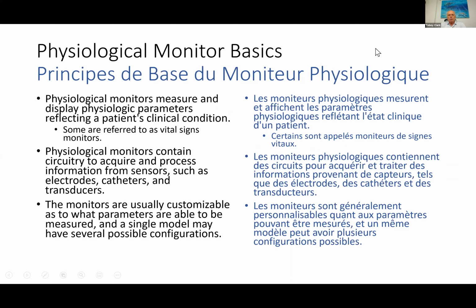These are largely electronic devices with sensors. They take that information from the sensors and produce values and waveforms, and send data to the network. They're usually customizable, so you can have several parameters included in one physiological monitor, sometimes using a module and sometimes pre-configured.